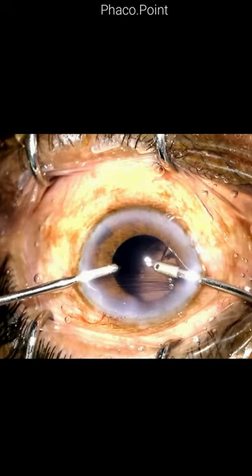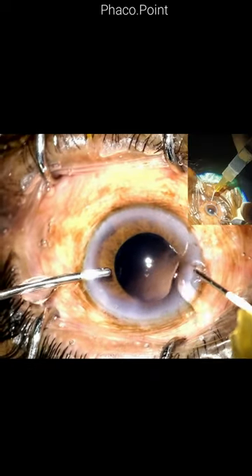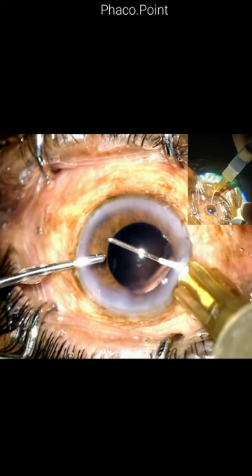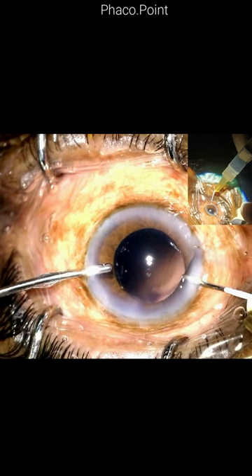Whilst continuing to maintain the irrigation port within the eye with the irrigation on, I first remove the aspiration cannula from the eye, then prime the visco cannula prior to introducing it well within the anterior chamber, and start to inject viscoelastic from the distal end backwards whilst simultaneously turning off the irrigation.